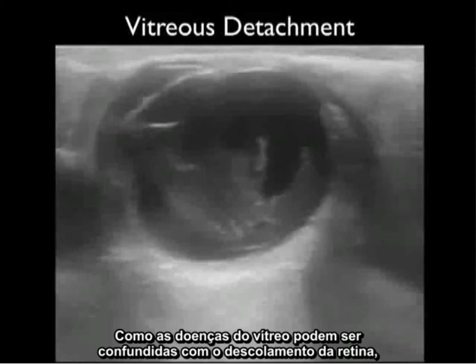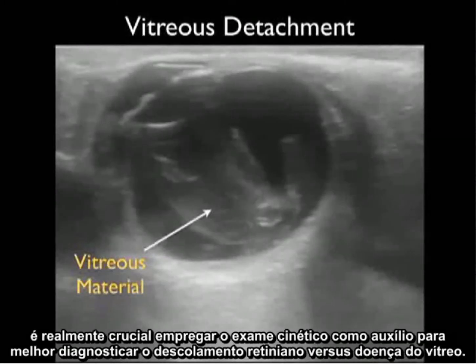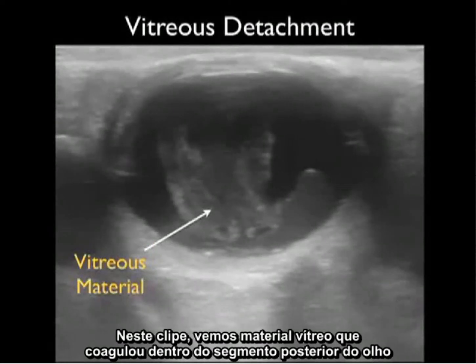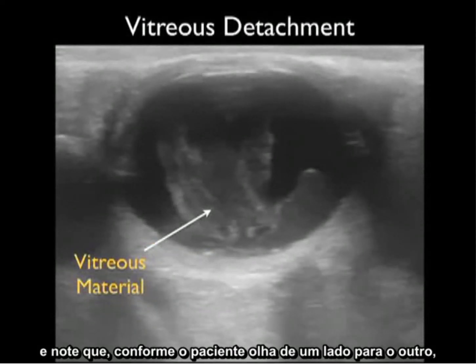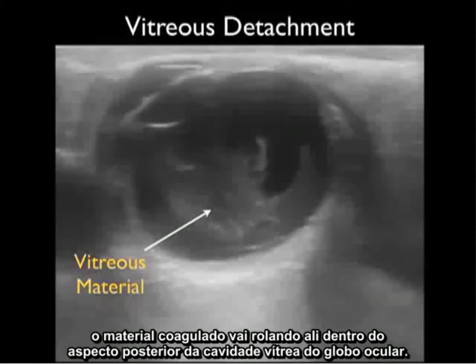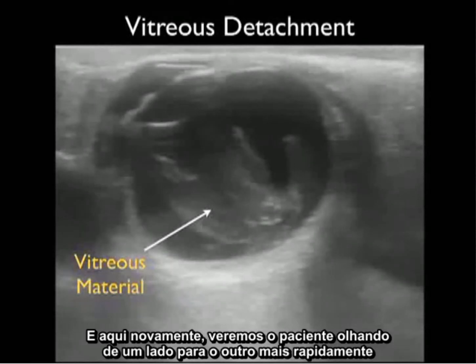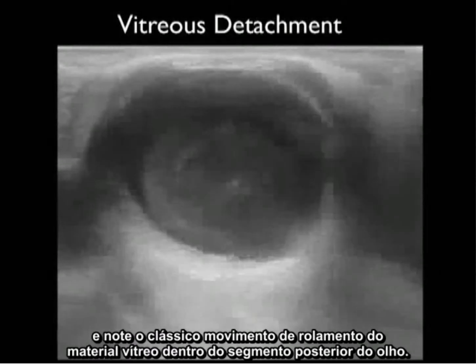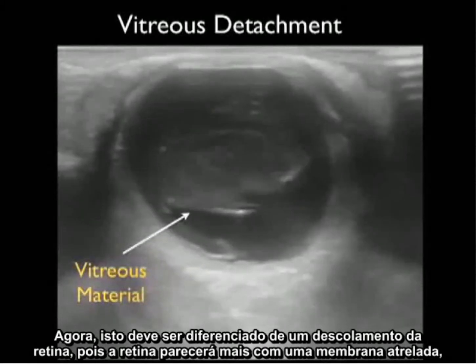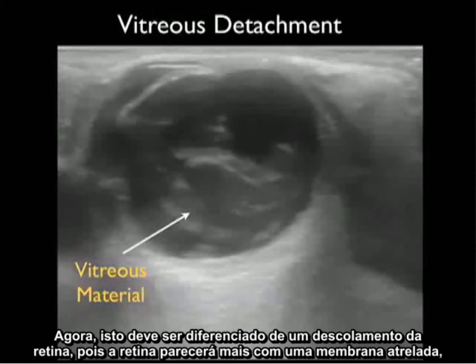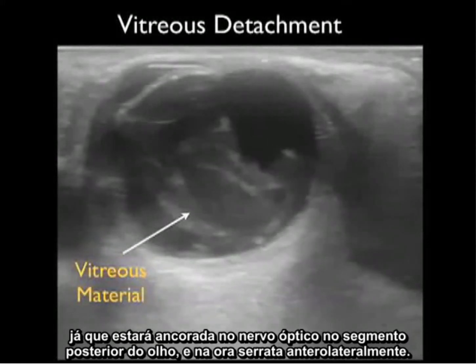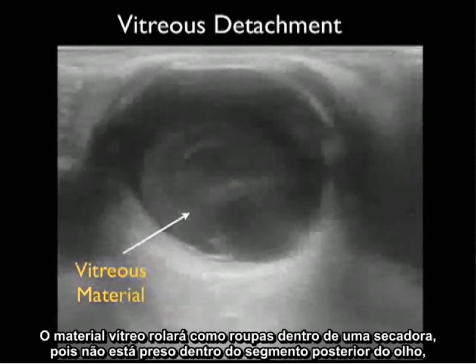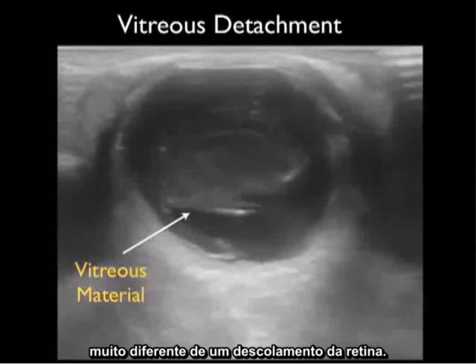Because vitreous pathology can be confused with retinal detachment, it's crucial to employ the kinetic examination to best diagnose retinal detachment versus vitreous pathology. In this clip we see vitreous material congealed within the back of the eye, and as the patient looks from side to side it tumbles around within the vitreous cavity. Notice the classic tumbling motion of the vitreous material. This is to be differentiated from a retinal detachment, as the retina will have a tethered membrane appearance — attached at the optic nerve and anterolaterally at the ora serrata — while vitreous material tumbles like clothes in a dryer.